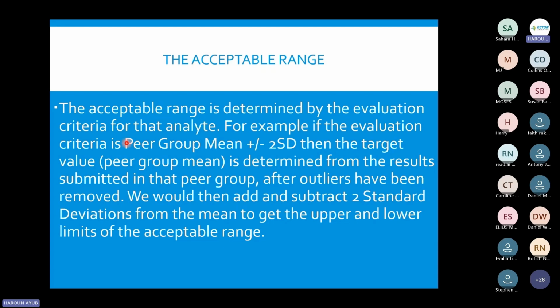That's 1 SD. When you go to plus 2, that's a 2 z-score. When you go to plus 3, that's a 3 z-score. So remember, in our grouping, we have the upper limit and the lower limit. The difference between upper and lower will be a difference of 6 standard deviations. So that's how you calculate in your IQCs.